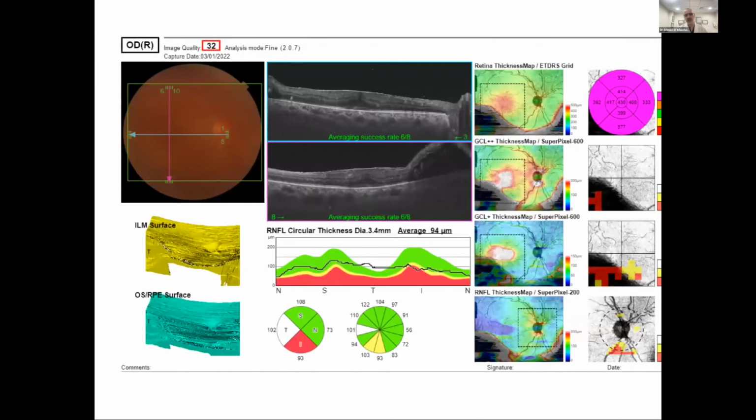And this is the OCT. The macula was still on, partially off. I think during the surgery, it was totally off. In the presentation, you can see even the gas bubble that was remnant.